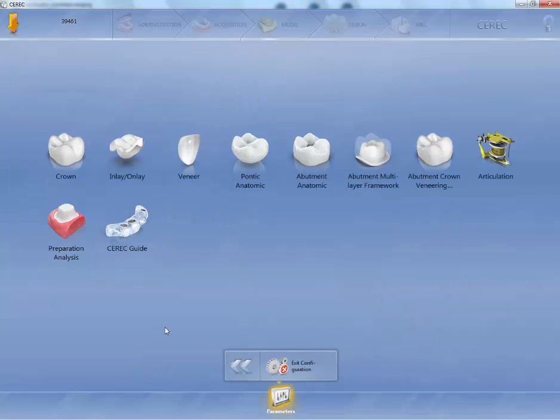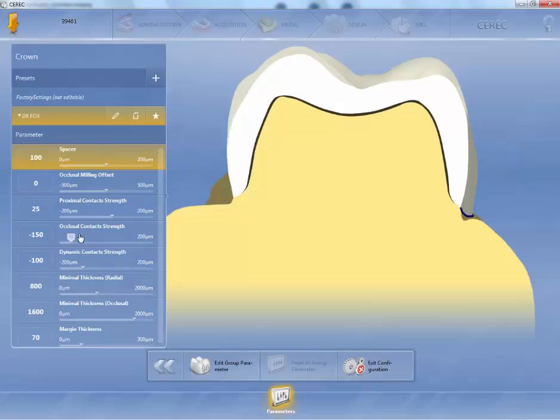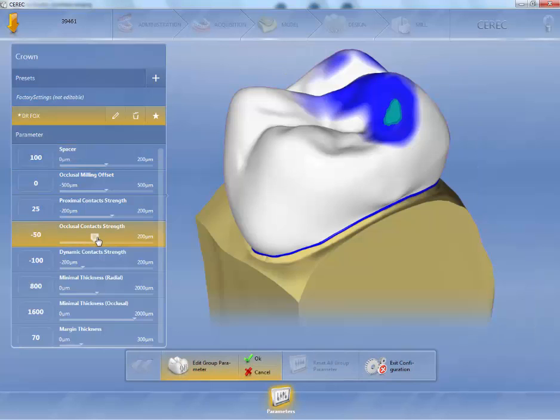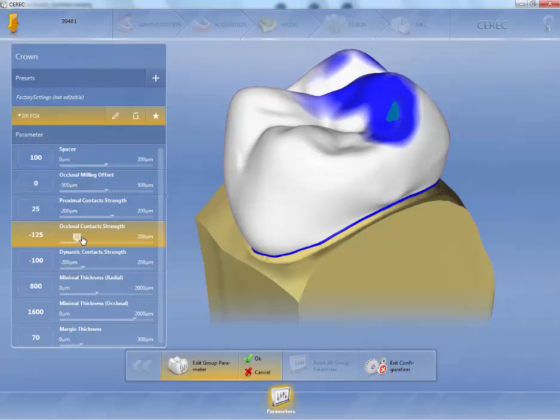And the one comment that I am going to say about this is if you ask 6 instructors what their parameter settings are, all 6 of them will probably give you something different. The main thing is remember that if your occlusion is too high, you can adjust it in the inter-occlusal contact. So again, if I went to crowns, I could adjust this occlusal contact strength. If it's too high, I can set this to minus 175. If it's too low, I can set it to minus 125. This is how you dial these machines in so you'll get a perfect fit.